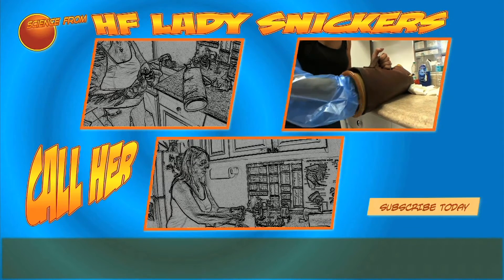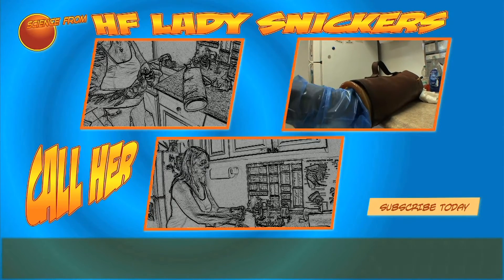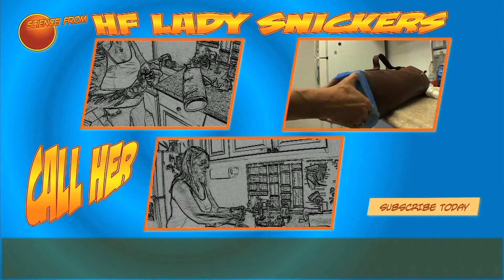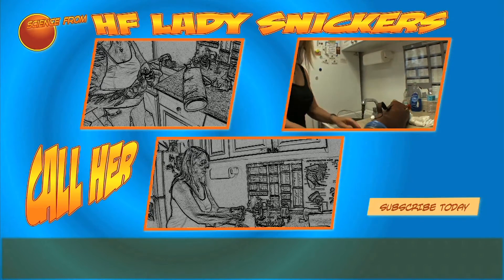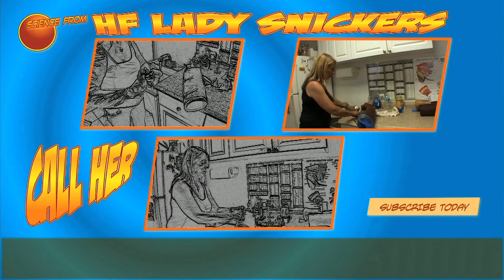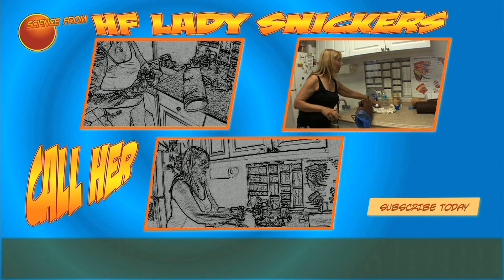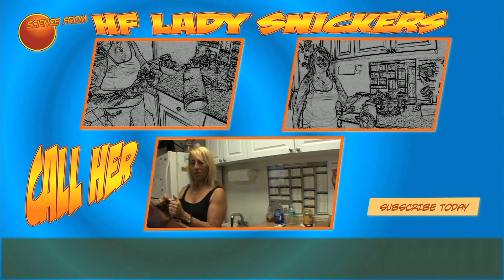I can't leave the glove all the way in because it's warm enough it could melt. So I'm making a fist, putting it a little ways in and then covering the outside. We'll remove that when we're ready. This way we're keeping it secure and fairly sterile. It's not a totally sterile situation, but there's so much dust with horses that we just do the best that we can. That is our finished AV.